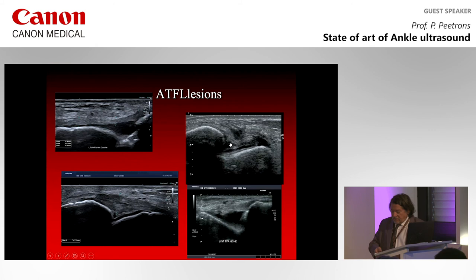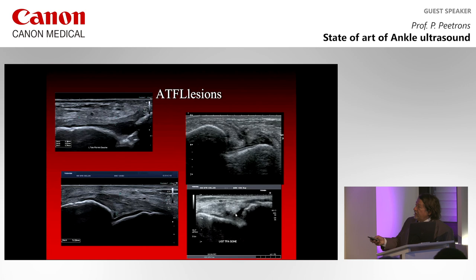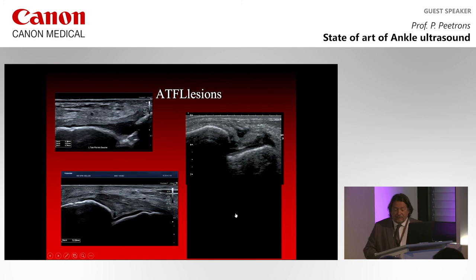So you can see here the acute lesion of an ATFL, where you see that the ligament is torn from the talus part and just floating into fluid. And here you can see also that the ATFL is also disrupted here, and there is a part of fatty tissue which is inside the ATFL.